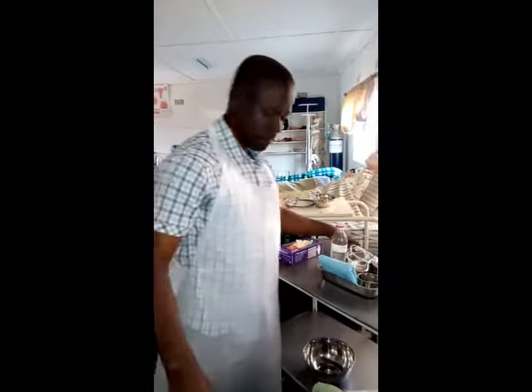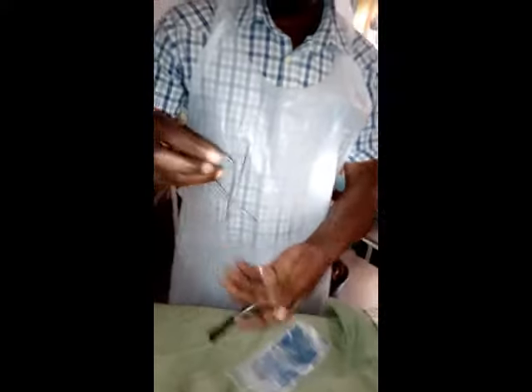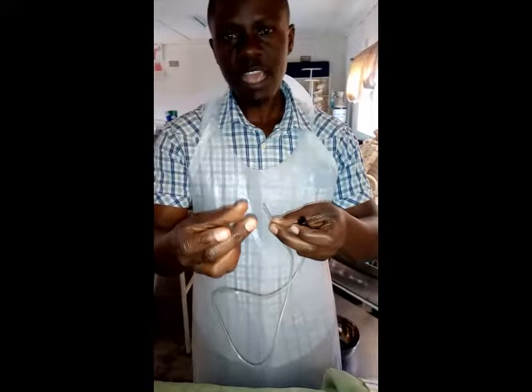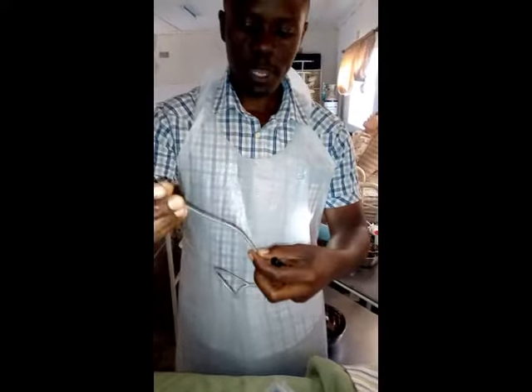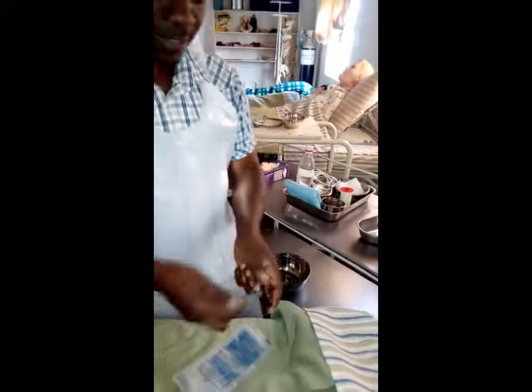Then we have a pediatric nasogastric tube, and it looks like this. But if you look at the size, it's much smaller because pediatrics are small, so we need something smaller. This tube has no spigot, as you can see, so you have to find something to occlude there. You have to be mindful to check if a tube has got a spigot. But the tube I have for an adult has a spigot.